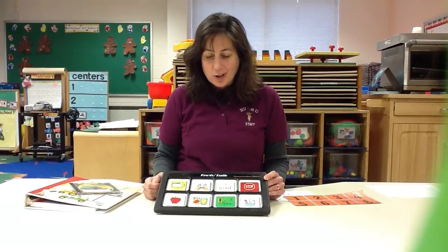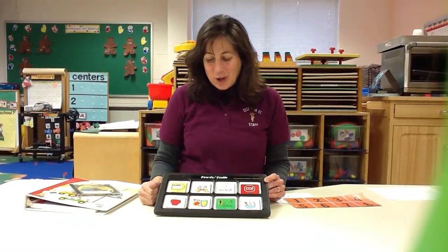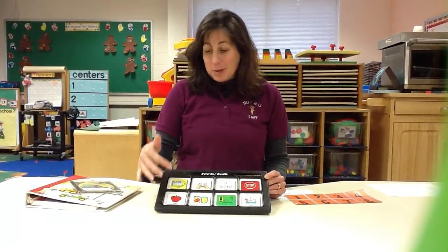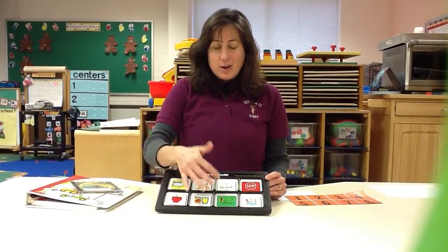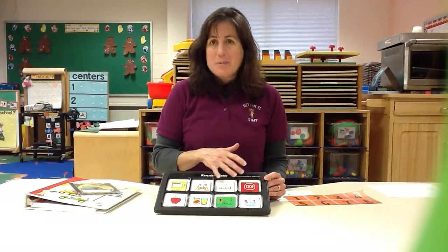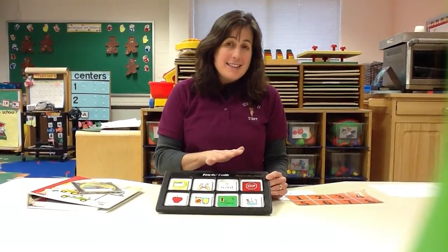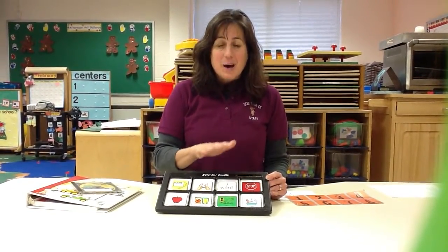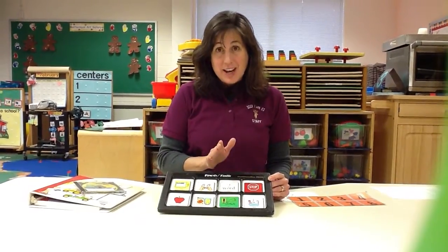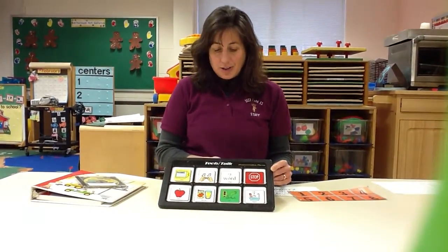So I had a little girl the same age as my student do the recording of these words, and you can see some of the words: eat and drink, functional words. Go can mean continue, go can mean turn the page, go can mean lots of things. Stop, same thing. It can mean stop this particular thing. It can mean I don't like this. It can mean stop this activity. It could mean I'm all done. And help, self-explanatory.